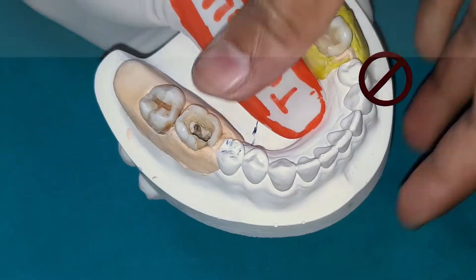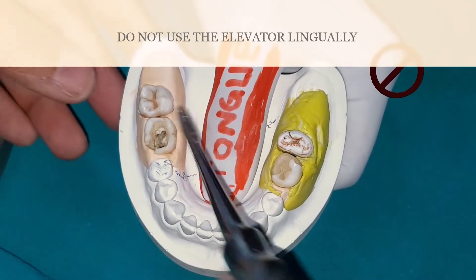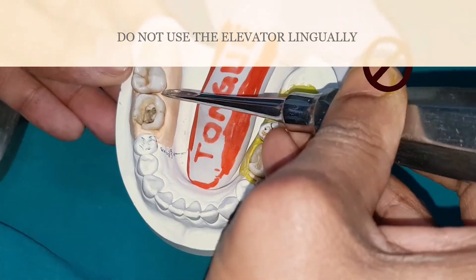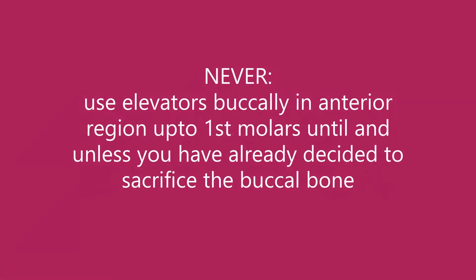Never use the elevator lingually — not like this, or like this, or like this. Also, never use elevators buccally in the anterior region up to the first molar, unless you have already decided to sacrifice the buccal bone.